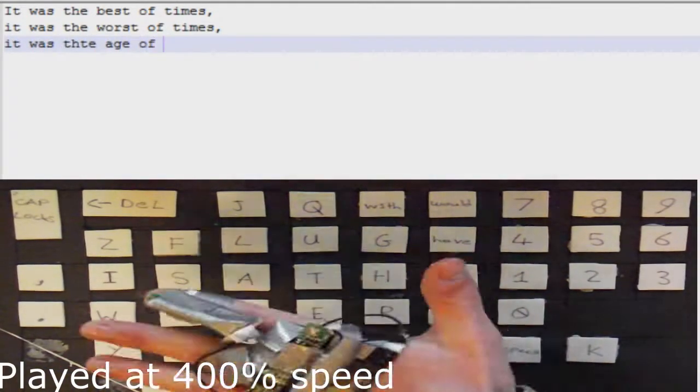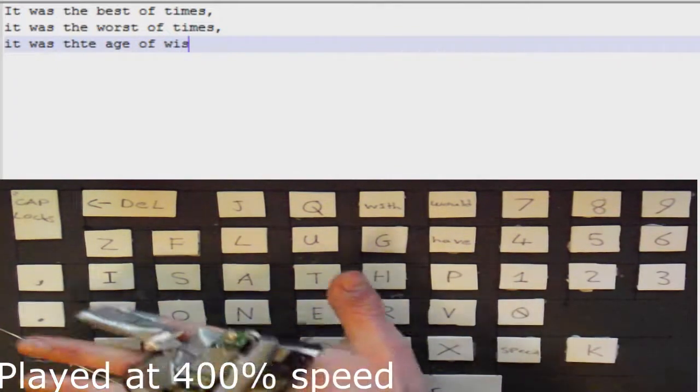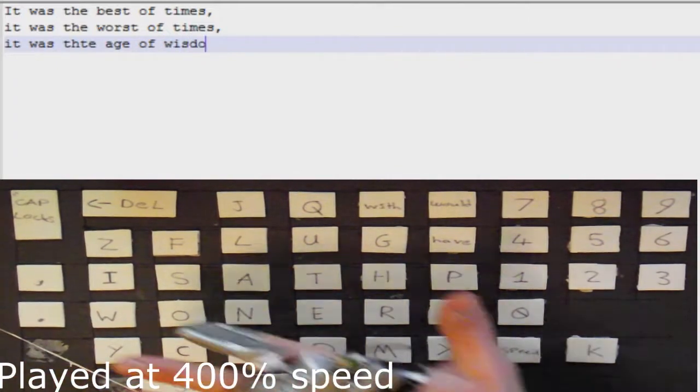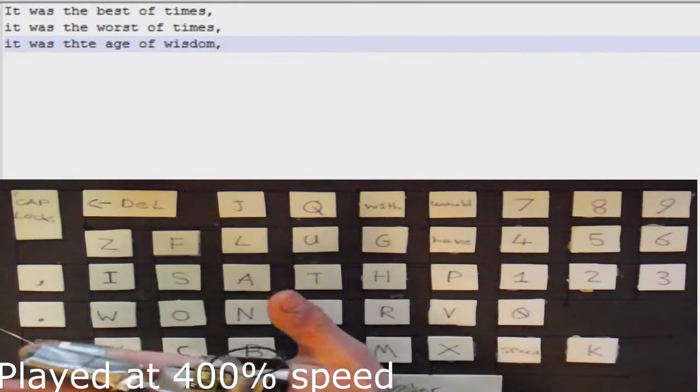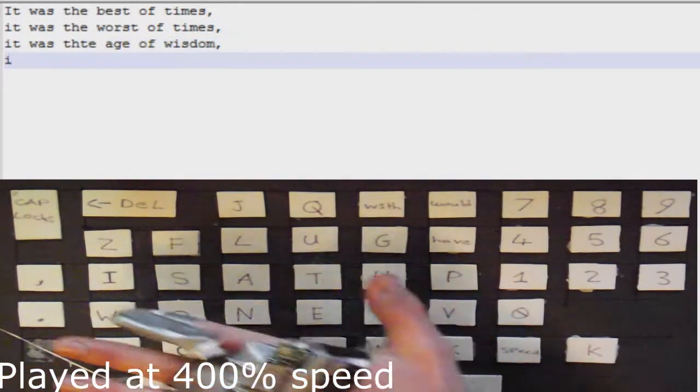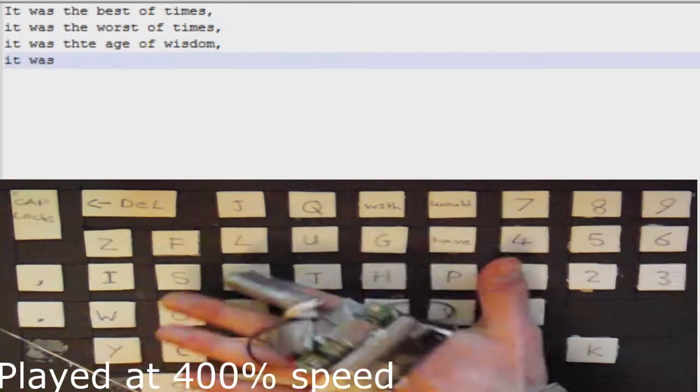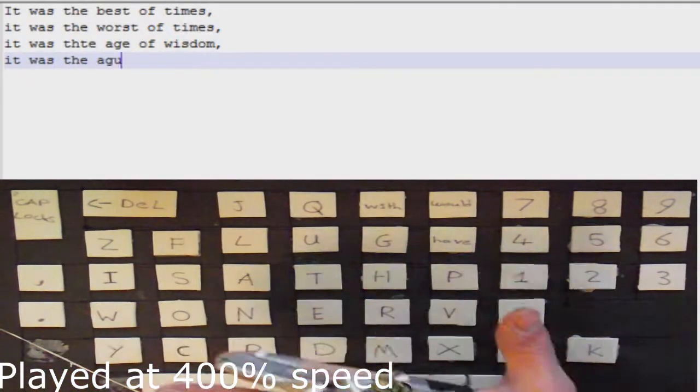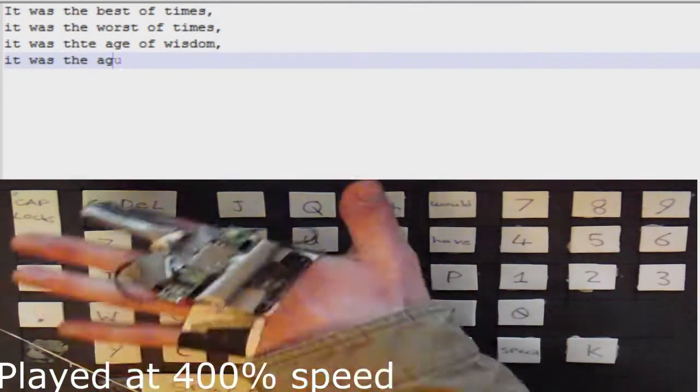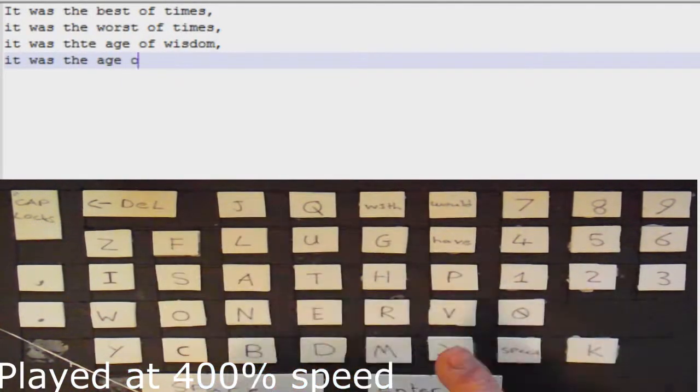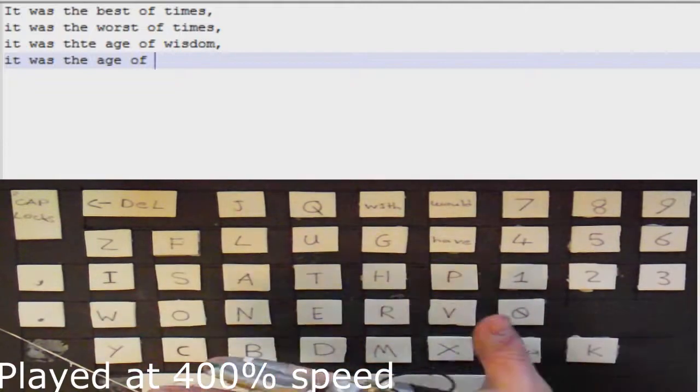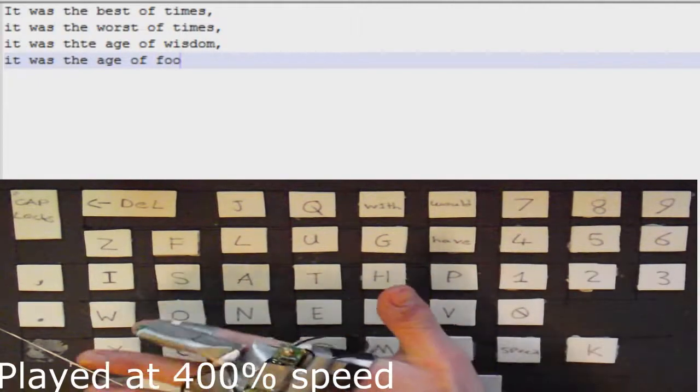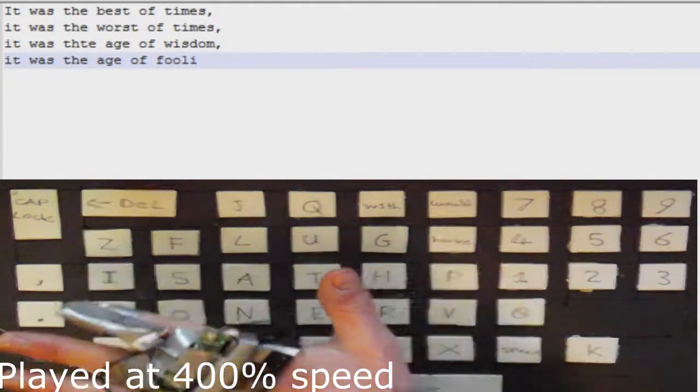It also has the advantage of being far cheaper than custom created devices for disabled people. The device I am mimicking right now is a one finger keyboard, generally used with some form of mouth stick. These devices retail at $650 a pop.